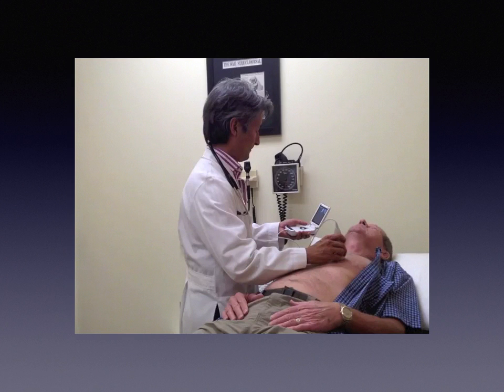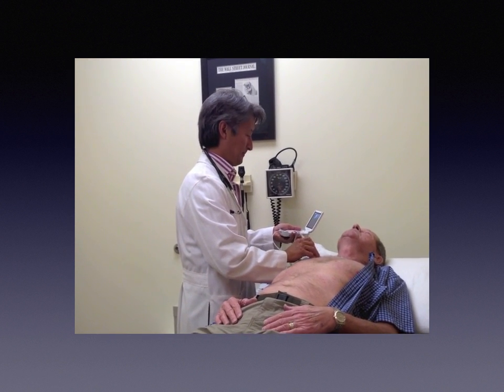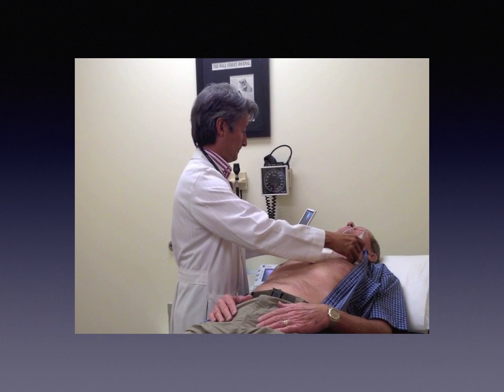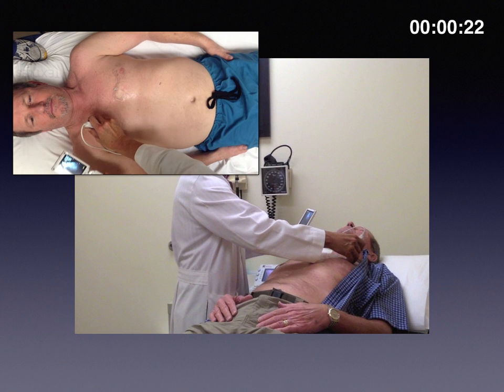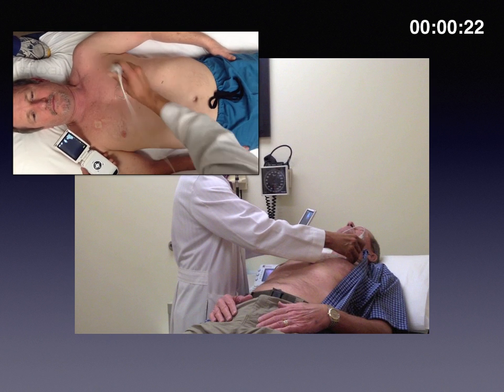All right, let's move on and take a look at whether the lungs feel the left atrial pressures, again working backward. So we're going to go from our parasternal long axis view here and look at the apices of the lung to see whether or not we see 3 B lines, or what we have called a comet tail artifact, occur. This is very quick. We do both sides to compare, and it takes now 22 seconds total to get us through the parasternal long axis view and the 2 apical views of the lung.